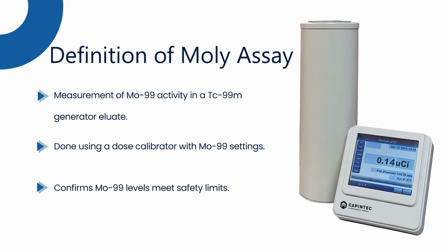So it is basically measurement of Moly 99 activity in technetium 99m generator eluate. Means how much Moly activity is there in the technetium 99m generator eluate, and it is done using dose calibrator with Moly 99 settings. We'll see how it can be done, and it confirms the Moly 99 levels meet the safety limits.